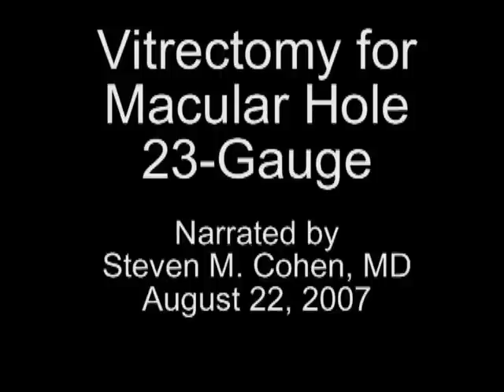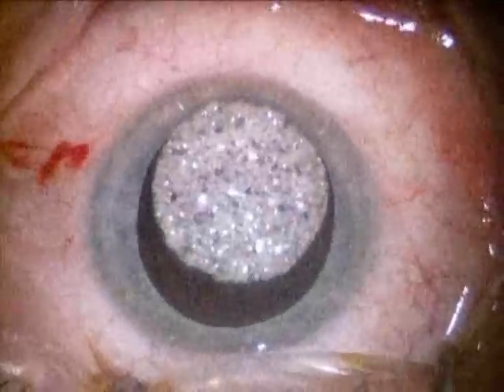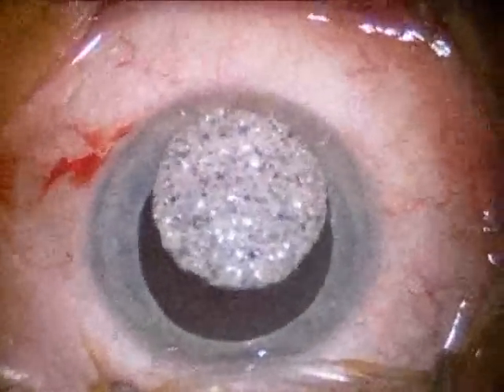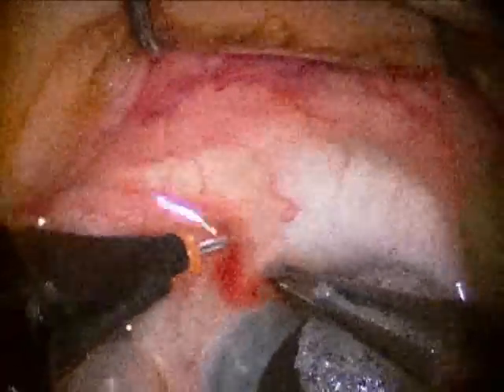Greetings. I'm Dr. Stephen Cohen and I'm narrating a vitrectomy for a patient with a macular hole. This surgery is being done with one of the small incision systems — a 23-gauge system — and the instruments are slightly smaller than the ones we use for a standard vitrectomy.